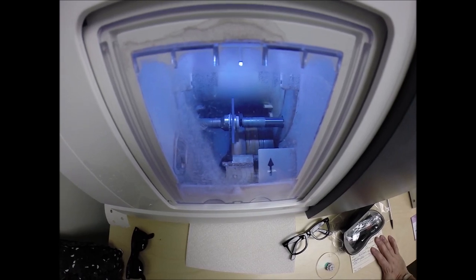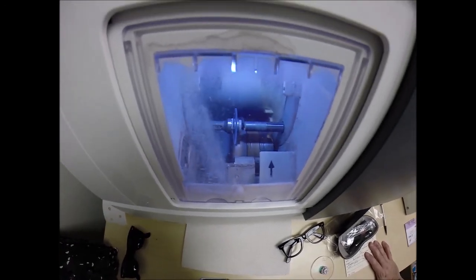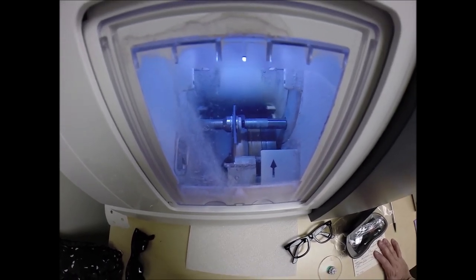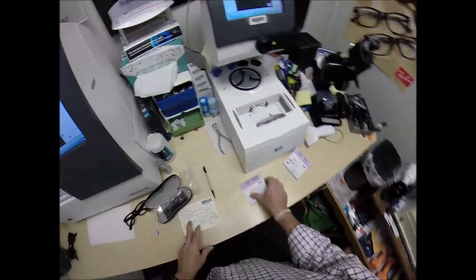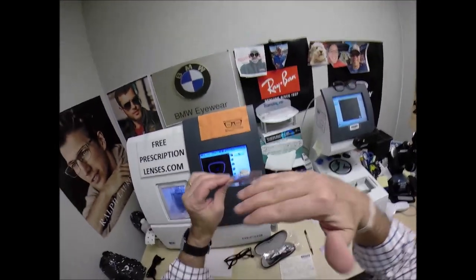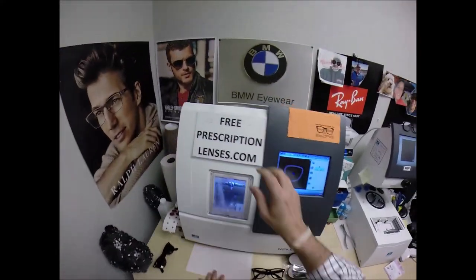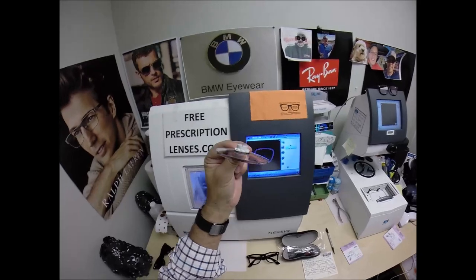These are high impact, ballistics-grade lens material — the same lens material that our soldiers wear overseas in combat zones to protect their eyes from shrapnel and flying debris. They have 100% UVA and UVB protection built in, as well as a premium scratch coating. Your eyes are eight times more sensitive than your skin, so you have permanent sunscreen for your eyes, unlike lotions and creams that need to be reapplied every couple of hours. Your lenses are also aspheric — aspheric simply means not spherical. A spherical lens is round in every direction giving an ugly cosmetic look; these are flatter to fit today's flatter curvature frames.